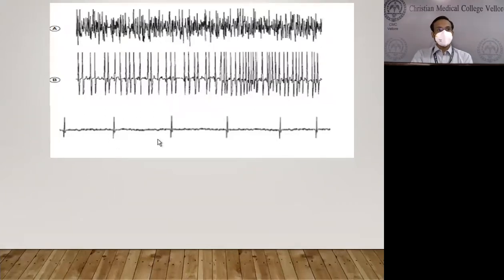Even patients who are poorly cooperative, or who have pain and don't activate, might give us this. So in a patient who has spasticity, we might get such reduced recruitment because of the spasticity. It's a unique condition in ALS where the patient has both LMN and UMN dysfunction, though one might see both.